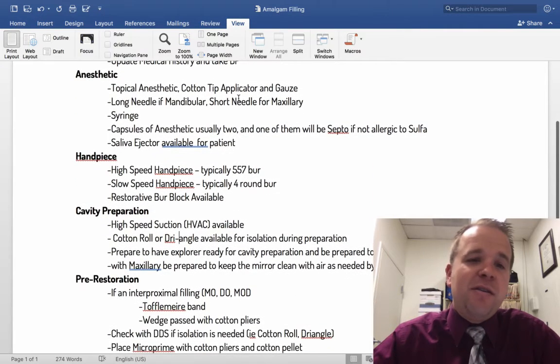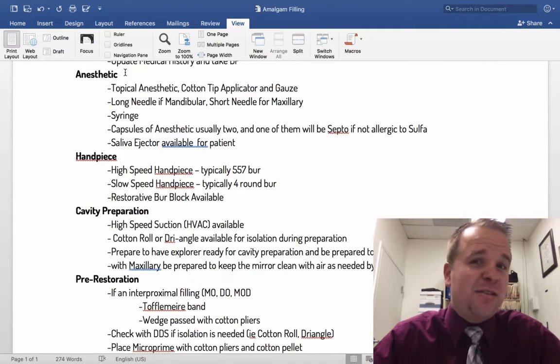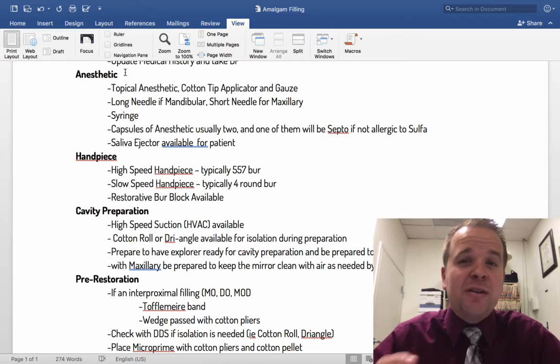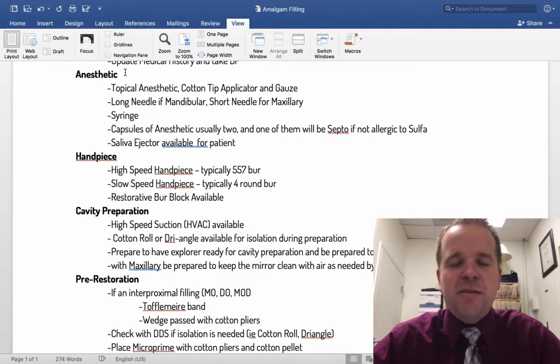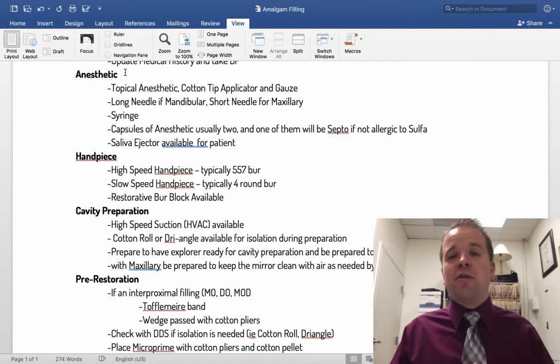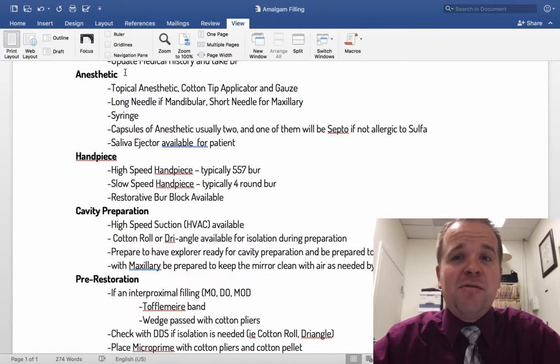So then, moving to anesthetic. First, we'll teach you how to place topical anesthetic, for which teeth we like to put the anesthetic in which location. This is where we put numbing gel down on their gums. At some point, we'll probably teach you how to do it, but for starters, just make sure the dentist puts it in the right spot. As you get trained and go through it more, you'll be able to place that topical. We usually don't want to place it too early. We only want it on there for 30 seconds to a minute, maybe 2 minutes at most, because it kicks in really fast, and we don't want to have it there too long.